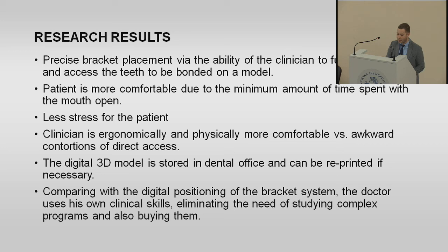The clinician is ergonomically and physically more comfortable versus the awkward conditions of direct access, for example, lots of saliva and so on. And the digital 3D model is stored in the dental office and can be reprinted if necessary. So you're not locked into having a certain room for all your models for 5 years for every single patient. And compared with the digital positioning of the bracket system, the doctor uses his own clinical skills, eliminating the need of studying complex programs and also buying them, because they're quite expensive nowadays.